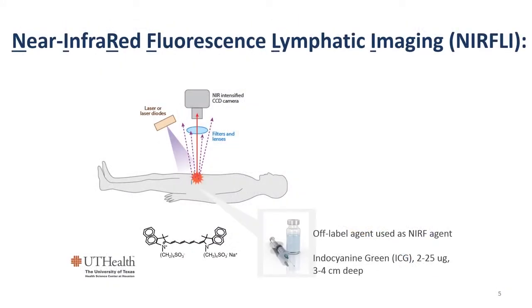We've decided to develop a point-of-care imaging that's based upon near-infrared light. It's light, it's non-radioactive, and so it's really simple to use. We're using indocyanine green, which is used in studies of hepatic liver function. What we do is inject a trace amount right underneath the skin. That dye goes right into the lymphatics, and it has a fluorescent property.